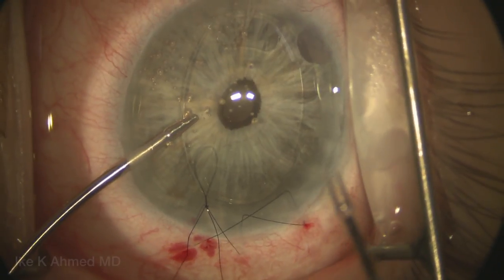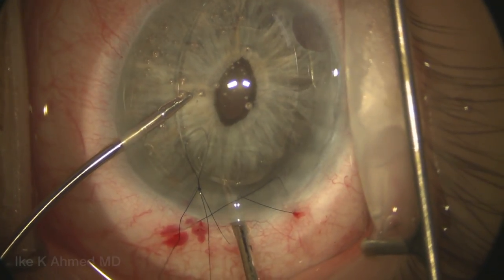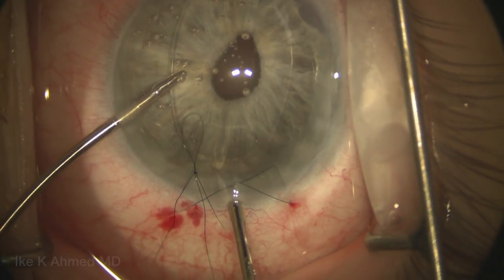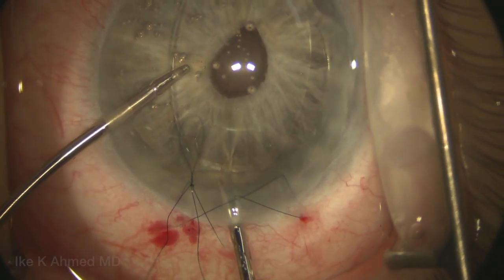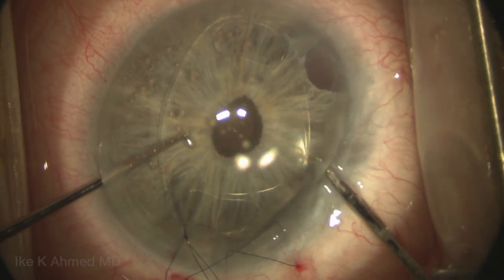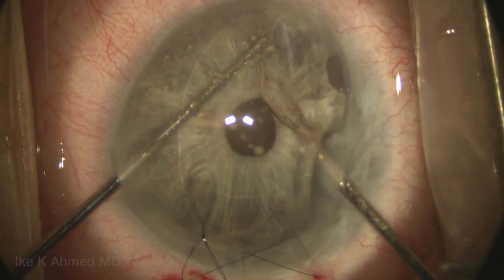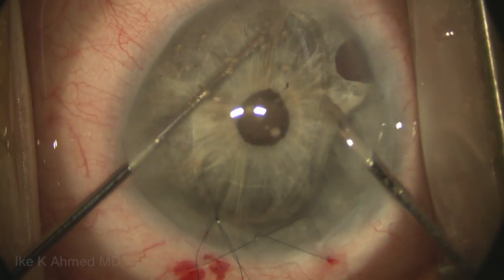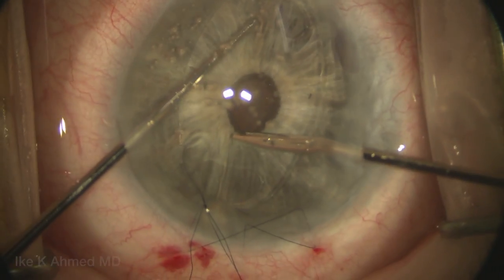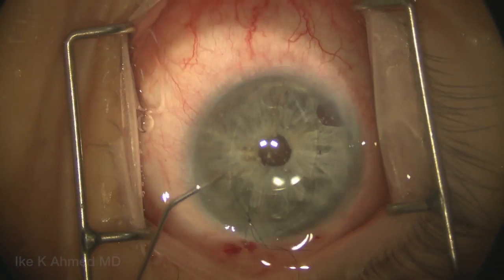Once we have the nasal haptics enclavated, we will then go through the temporal incision. It helps to have the sutures in place with viscoelastic in the anterior chamber to prevent shallowing. We grab the iris at the intended site of enclavation, splaying open the haptics and pulling the iris through. It helps to position the haptics in the area of the final intended implantation site. Here we can use the Sinski hook for counter-traction as we pull the iris to the center to move the lens nasally, centering the lens and avoiding pupil ovalization. We can do the same on the temporal side, pulling the iris toward the pupil and pushing the lens temporally to center it ideally.